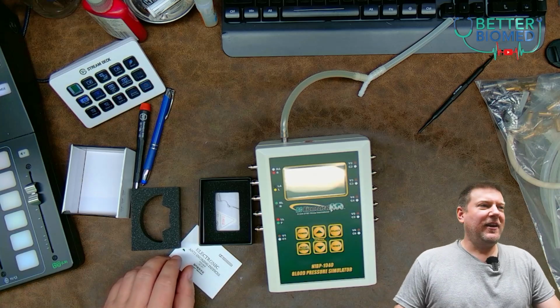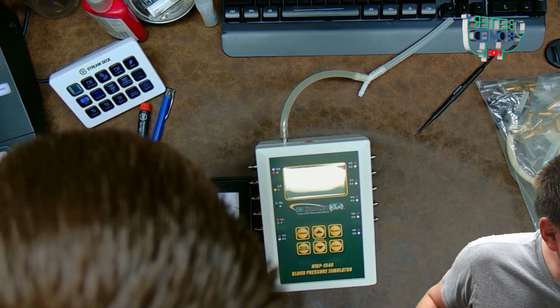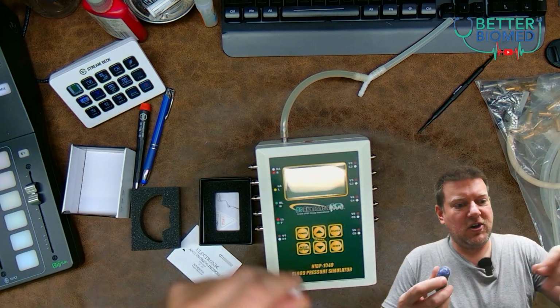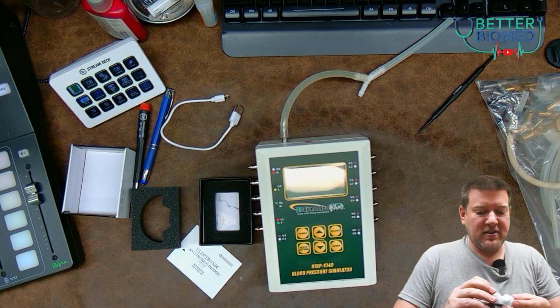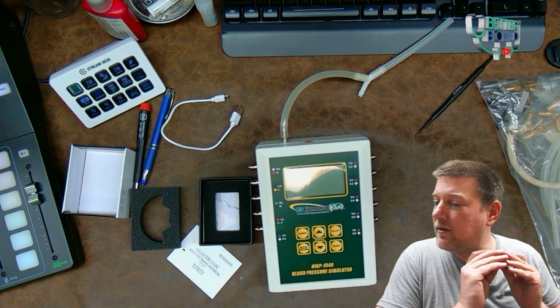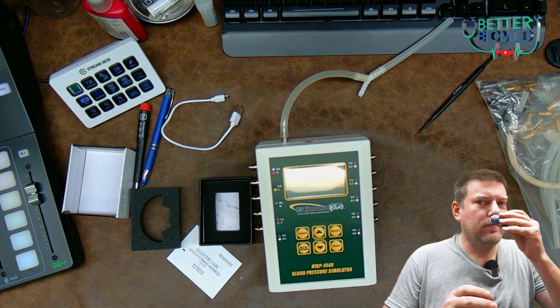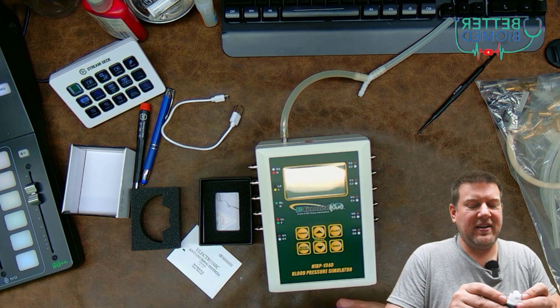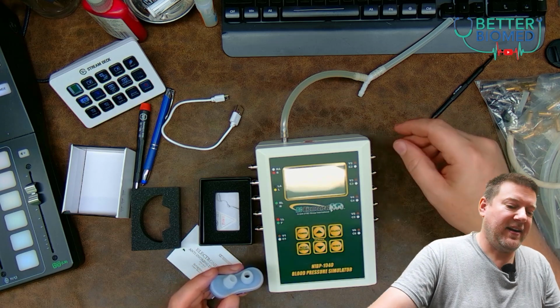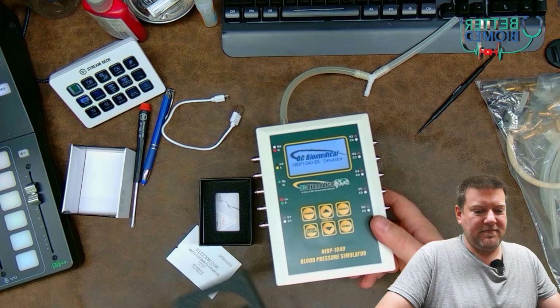All right, folks, it is officially hours later. It's evening time now, and I've got the little device over here. It has been charging, and it says that it's good to go. Tell you what, first off, let's see, does it sound any different? Oh my God. This is clearly a scam product, folks. All right, let's go ahead and turn this guy on. Let's give him the benefit of the doubt, right?